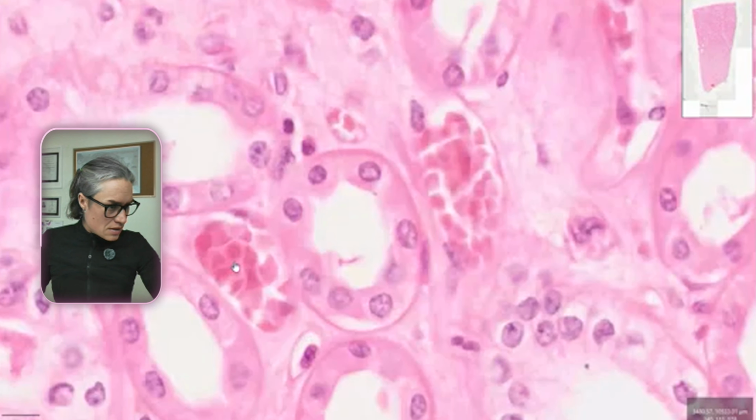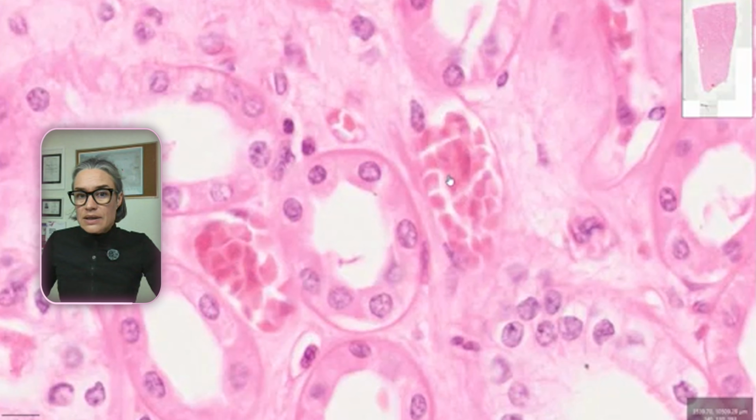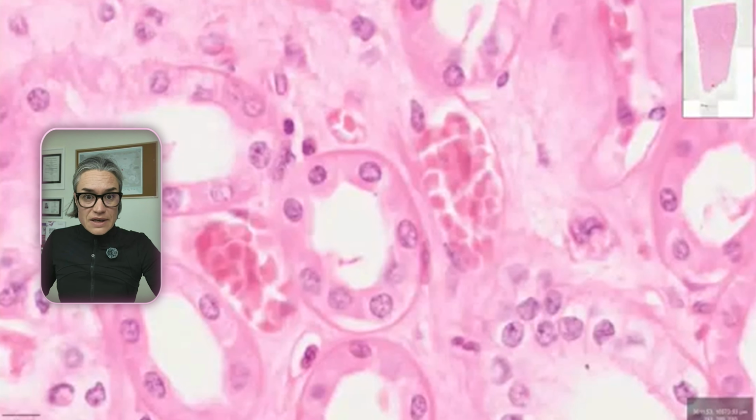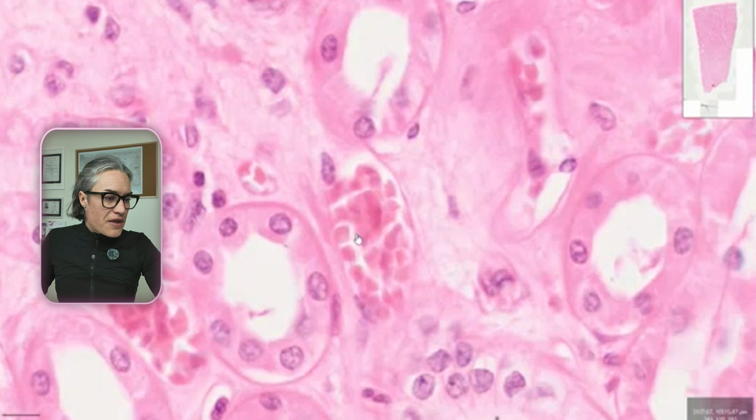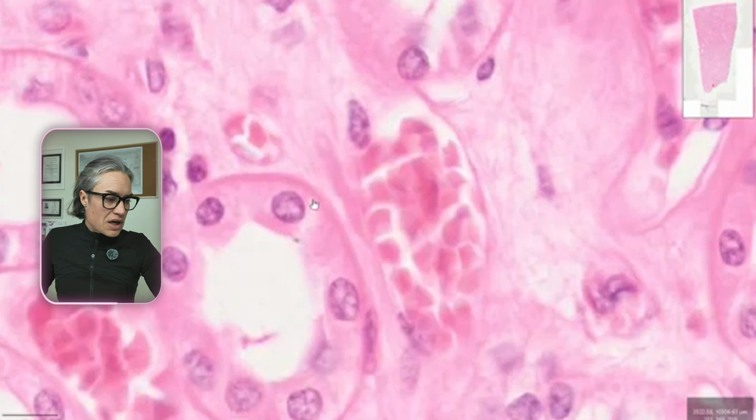So here, all these. Also, when you look at structures in tissue and you are asking yourself which one is a tubule and which one is a vessel, if you have something that has blood in it, then you're going to know that this is a vessel. Also, vessels have a very thin wall. The nuclei are flattened or elongated, not much thicker than the rest of the cell, whereas tubules have more plump cells and round nuclei. This is thicker, and obviously they don't have blood inside.